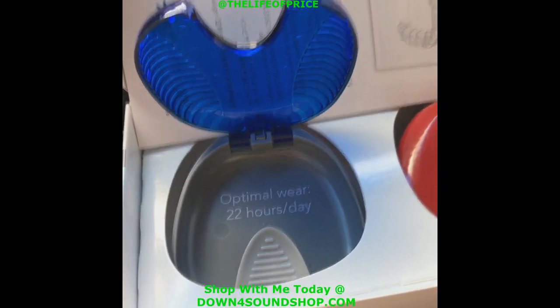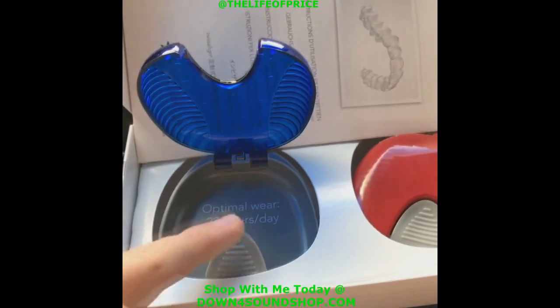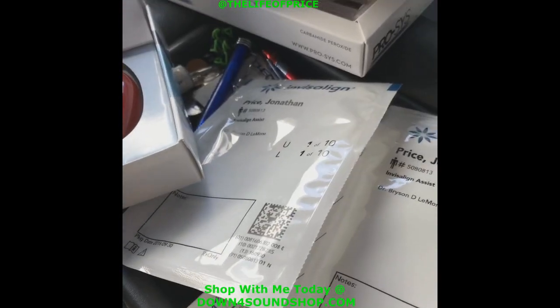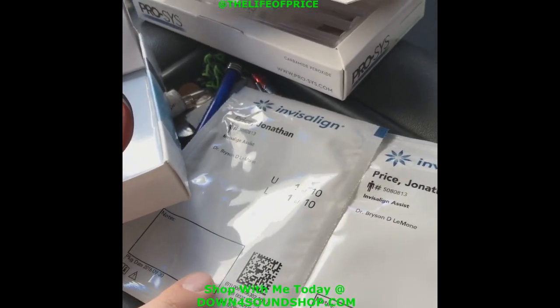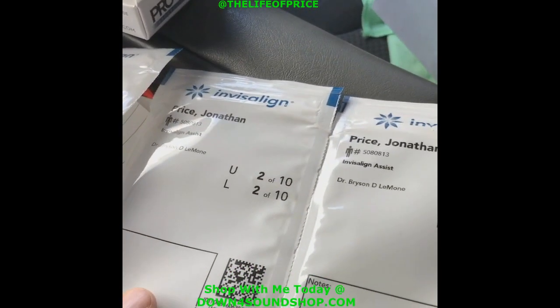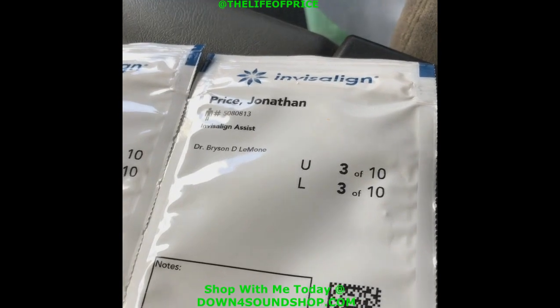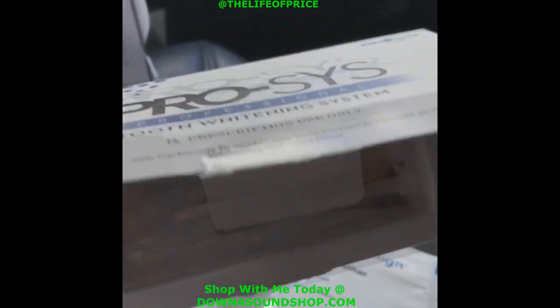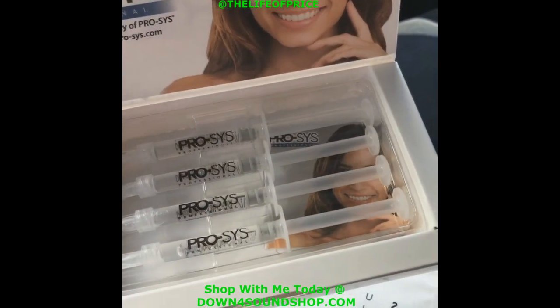They come with these little containers that you store your trays in. Your current one's going here, your old one's going here. Each set of trays lasts for 2 weeks. This is the first one that I currently have in, then the next 2 week period, and then the third 2 week period. So I have to come back in 6 weeks. I also got some of this whitening gel to help get the stains off my teeth before I get the buttons put on my teeth.